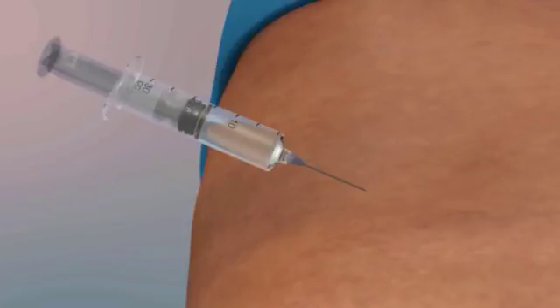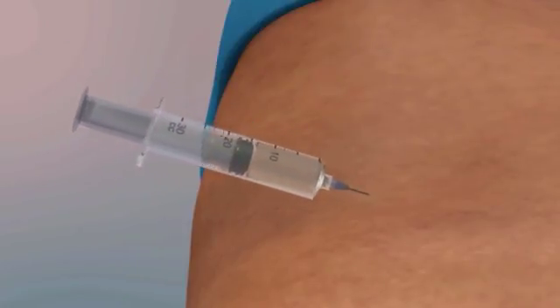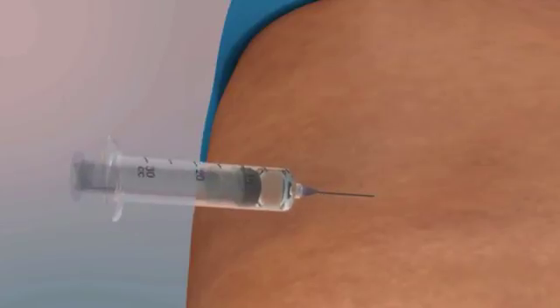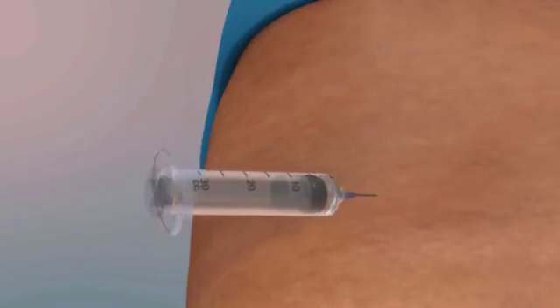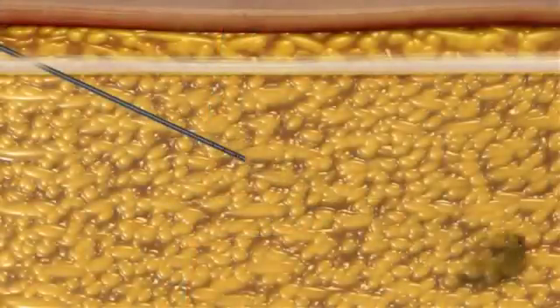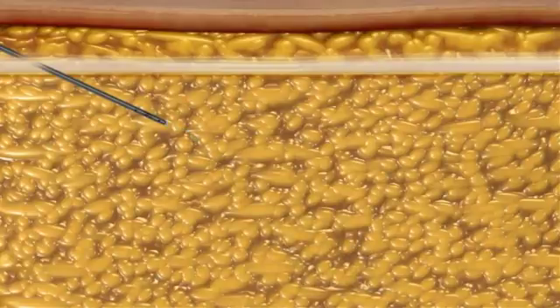It is important to evenly distribute the tumescent fluid during injection and avoid pooling of fluid within the donor site. Pooling of fluid will prevent adequate suspension of adipose tissue and result in collection of less adipose tissue upon harvesting. As a general guideline for small volume liposuction, at least 1 milliliter of tumescent fluid should be injected for every 1 milliliter of lipoaspirate to be collected.